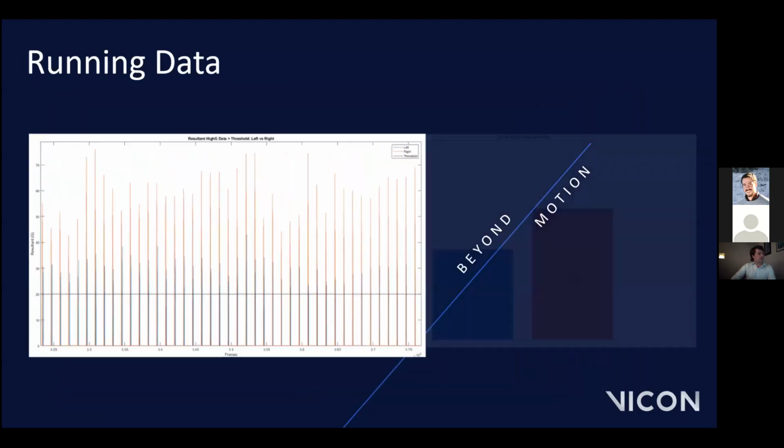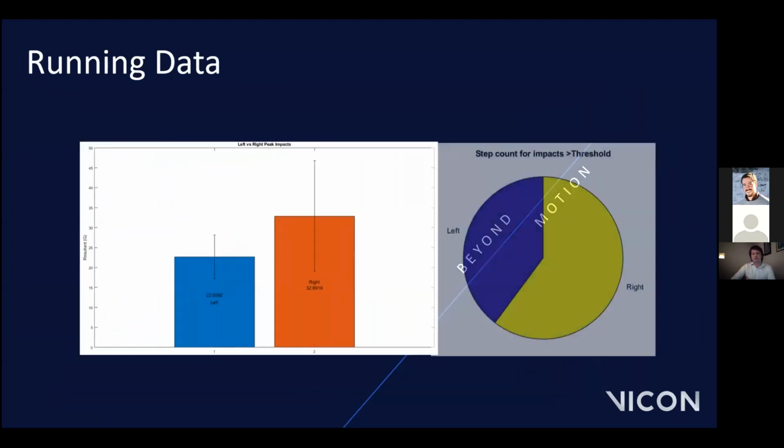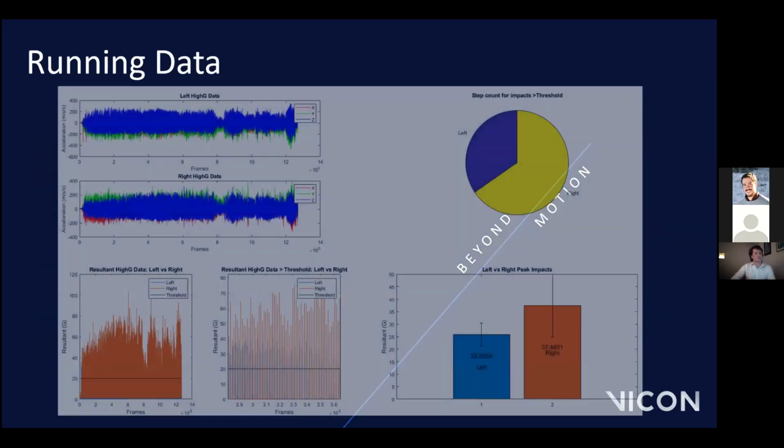We can then average those peaks for both the left and right side, which gives us an overall picture of the impacts from each leg throughout the run. So as you can see, I'm maybe slightly imbalanced here, favoring my right side. We can also look at the number of impacts which are above that threshold of 20 G, and where we can see I'm also having a much higher occurrence on the right side than the left side.